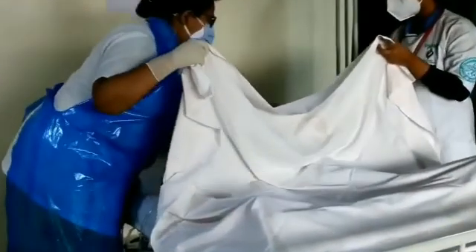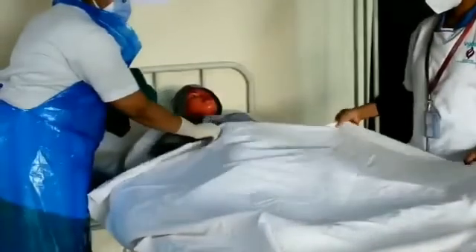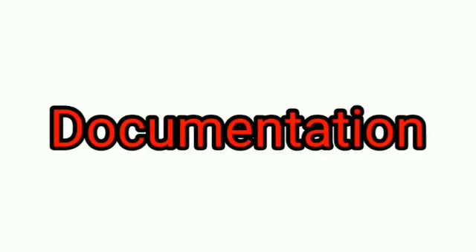Cover the patient up and remove the drape. Ensure the comfort of the patient. Replace the articles. Perform hand washing. And now we have to document the procedure as per the policy of the institution.